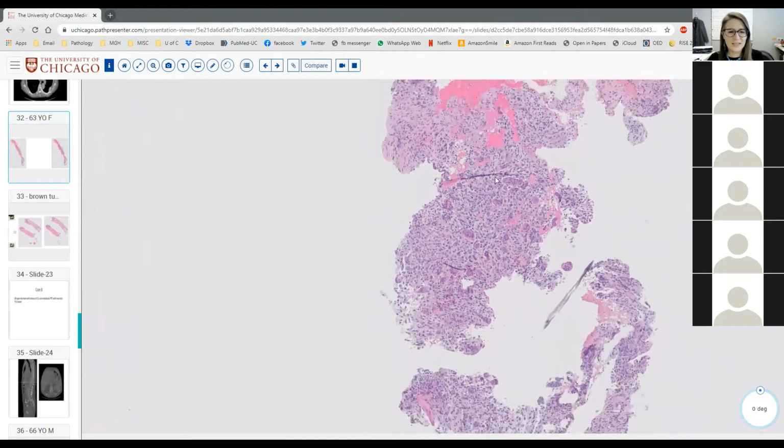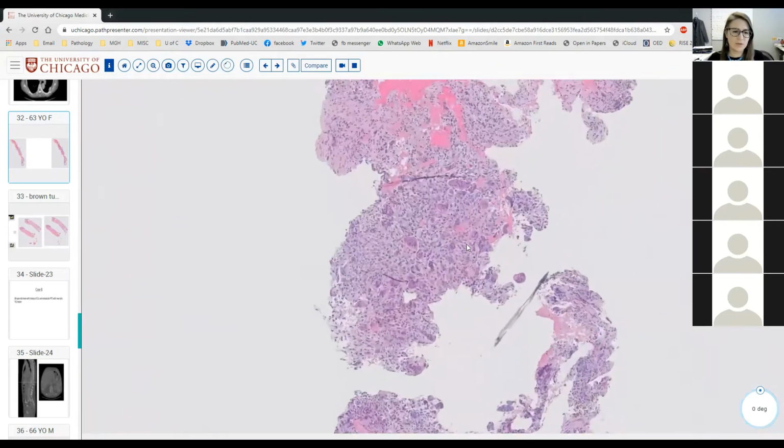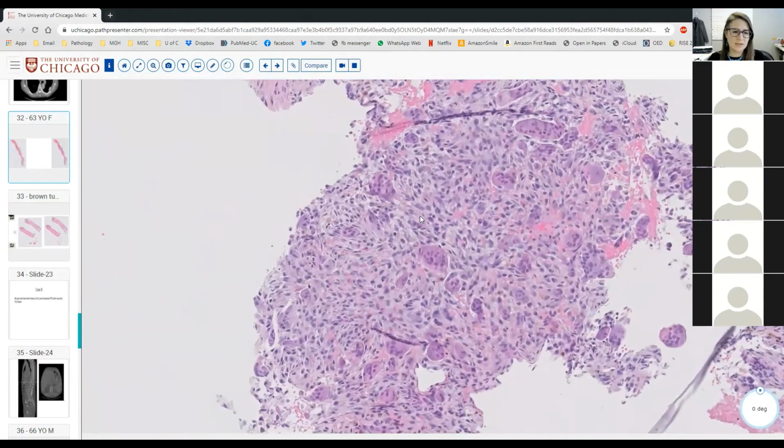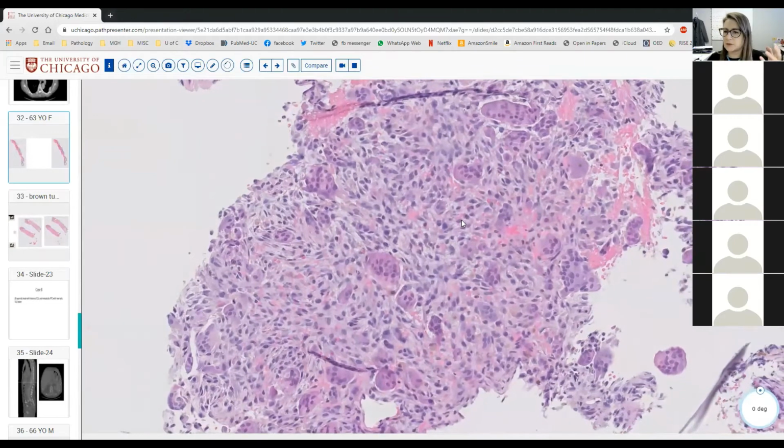Yeah, so I think aneurysmal bone cyst is an excellent thought, with blood-filled spaces and stromal-rich areas that are rich in giant cells, as well as these background spindly cells. Now, in this particular field, what is kind of missing? ABC can be present in any bone: face, ribs, long bones, any bone. What is missing here that you might expect to see in a true giant cell tumor of bone? What is different?